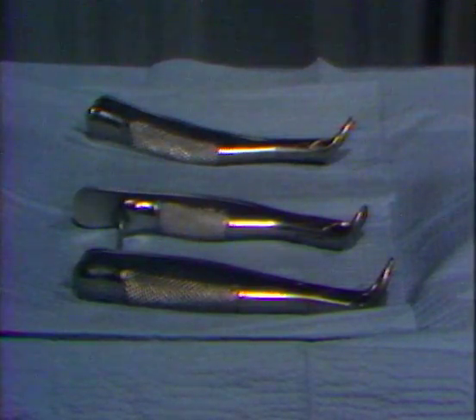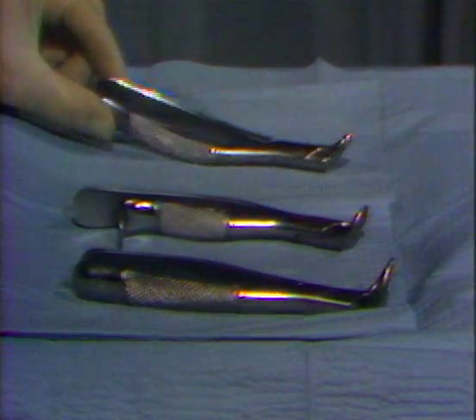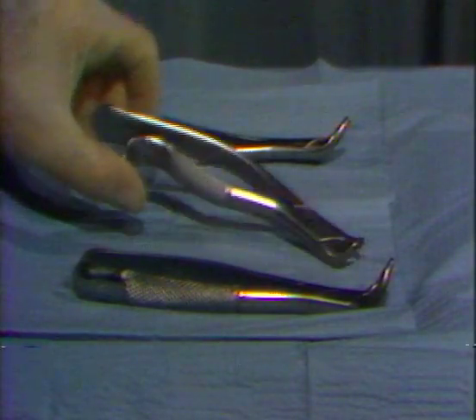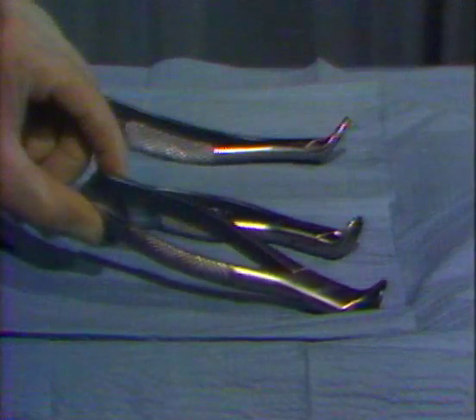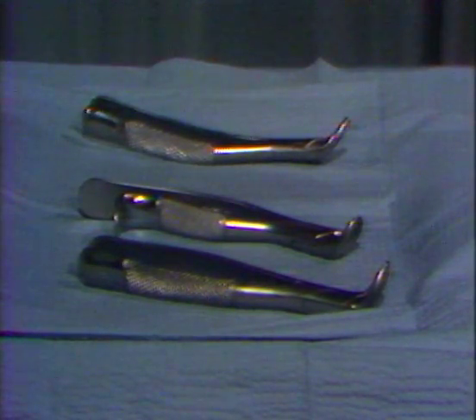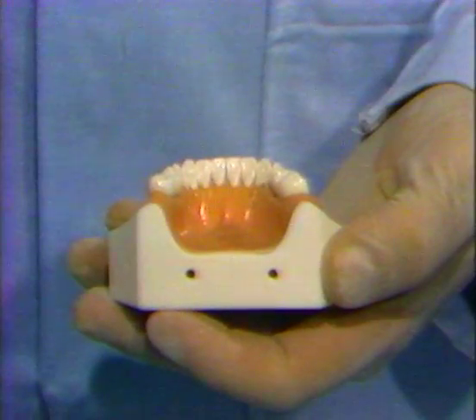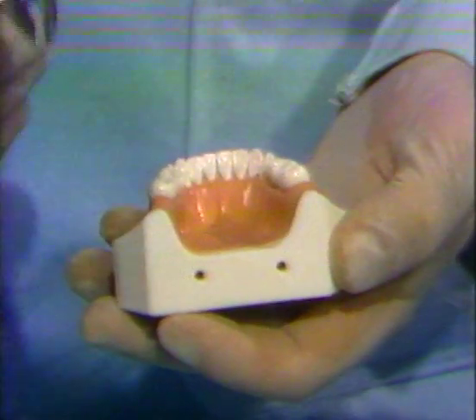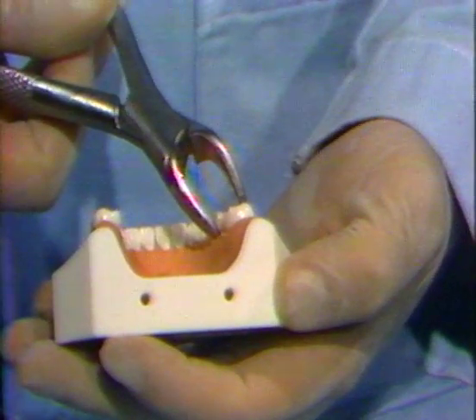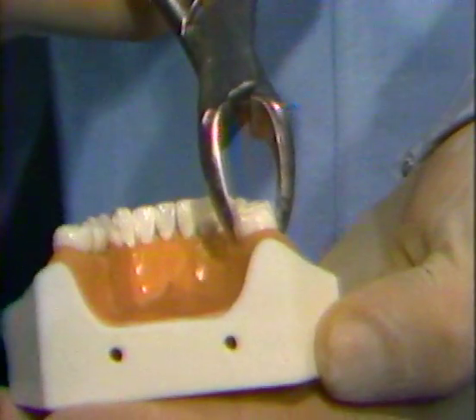For the extraction of the first and second molar teeth, we will employ the number 151 universal lower forceps. The number 23 or number 16 cowhorn forceps may also be used for the removal of these teeth. The luxation movements with either of these forceps is the same, but the placement of the beaks is different. The beaks of the number 151 forceps are placed below the mucogingival cuff, with the lingual beak placed first, followed by placement of the buccal beak. They are designed to engage the anatomical neck of the tooth.